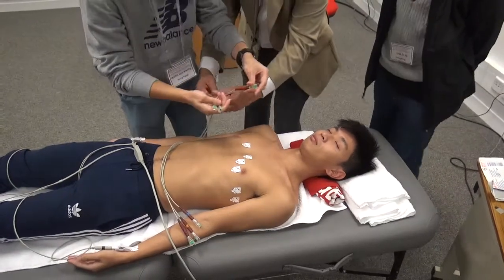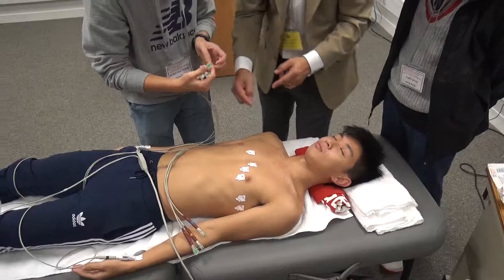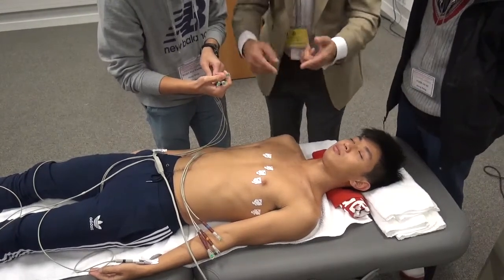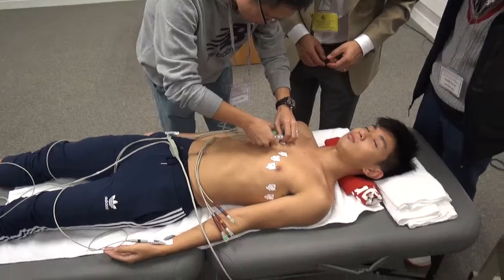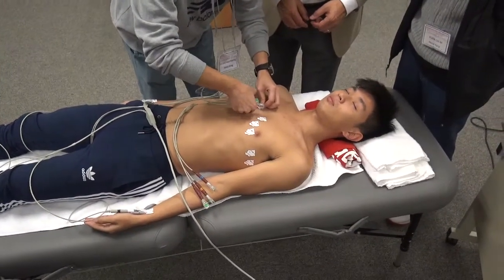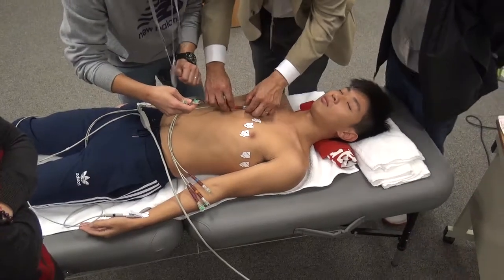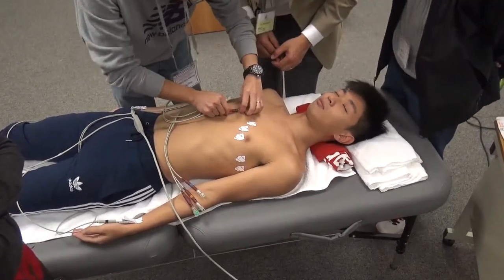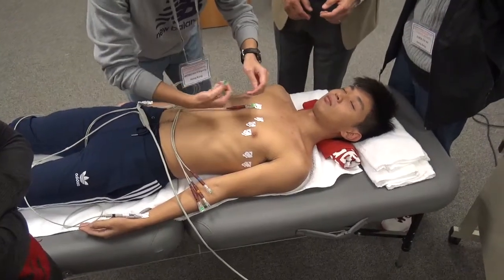Again, you've got this thing here, you can move this around, however you want to move it around and give it space. Now the important thing, when you put this on, you can twist it again to make sure it doesn't rotate, so that's how it goes, yeah. Good. Now, hang on, no, that's rotating. So what you want to do is you just want to rotate it like that. You rotate the bevel. You see? Sounds obvious. There, it'll hold.